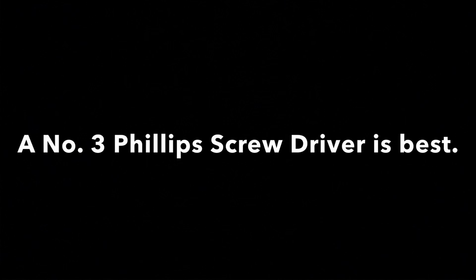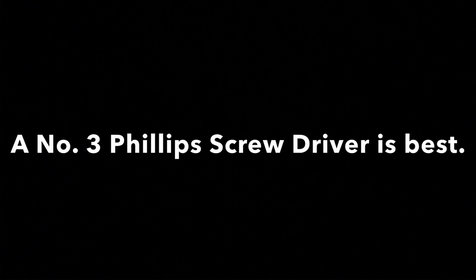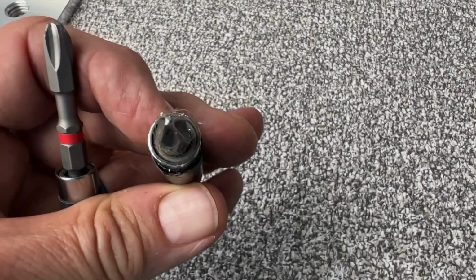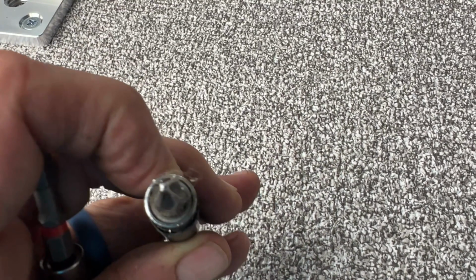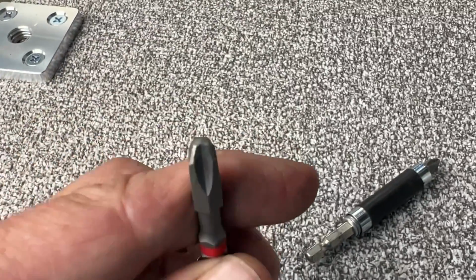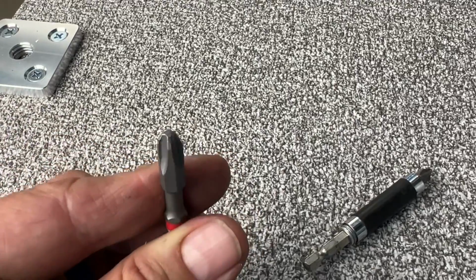When it comes to removing the bearings, we need to talk a little bit about the screwdrivers. The best screwdriver to use for the bearing screws is a number 3 Phillips screwdriver. As you can see, this is a standard number 2. It's a little smaller. Then we get into number 3, which has fatter blades on it and looks like a square on the tip of it.